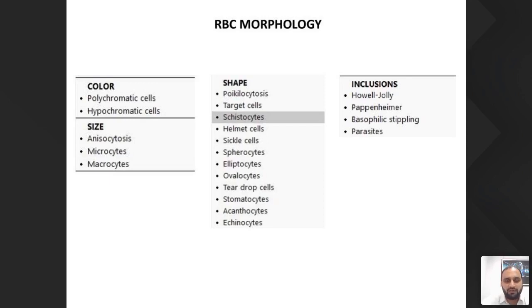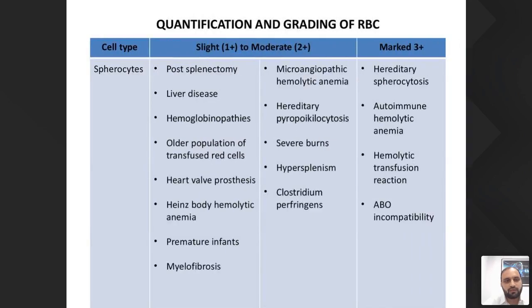Or we set in grades, but those are arbitrarily set, and we also report them on assumptions, which is quite subjective across various labs. Now, why is this important, to quantify and grade? That I'll come to in my next few slides. I hope I'll justify that. Yes, it is important to quantify and grade it.